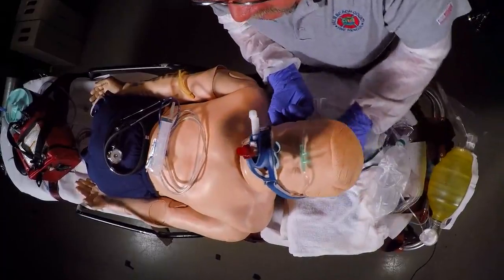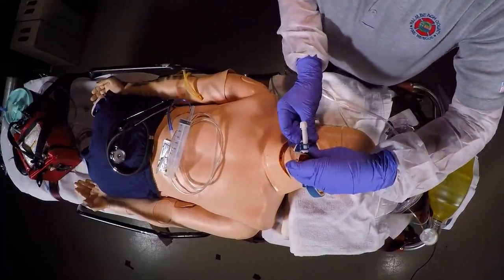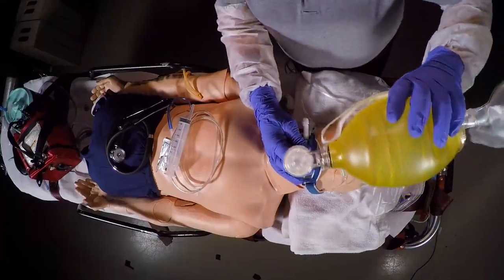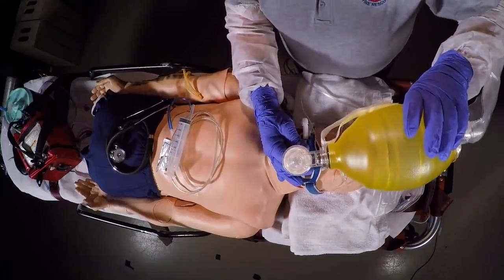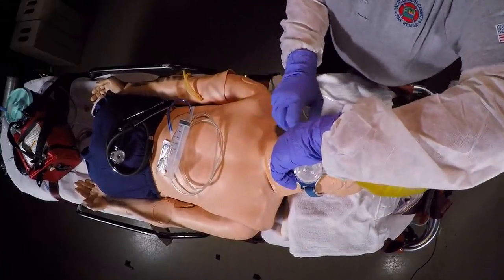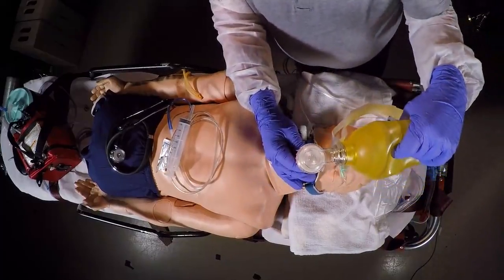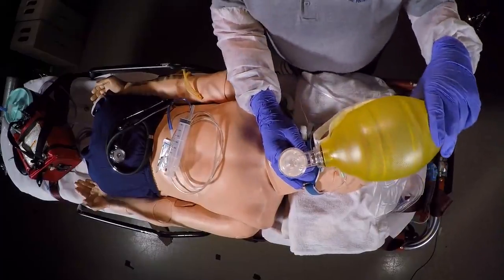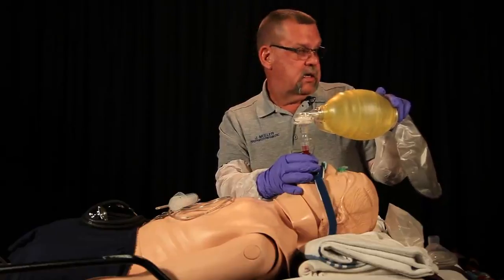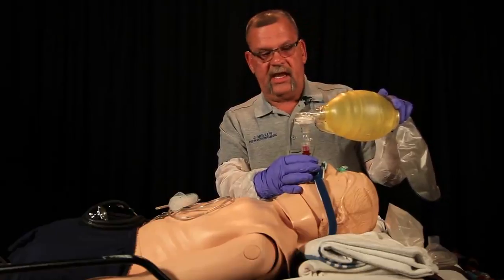We want to secure the Thomas endo lock to the patient. Continue to continually ventilate the patient. Retract the King Airway as required to have adequate chest rise, and then go ahead and secure the Thomas endo lock. We want to ventilate at a rate as provided per our protocol, and we want to monitor capnography and capnometry on our patient as we utilize the King Airway.